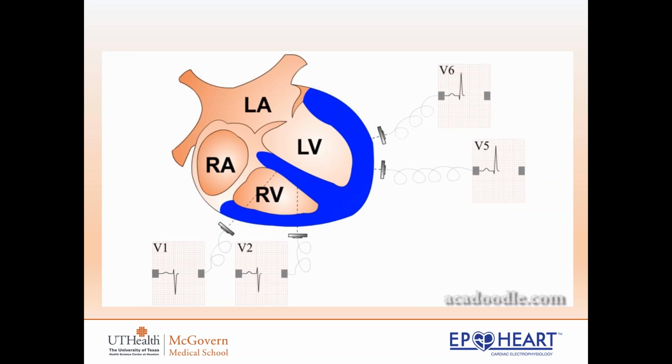When ventricular depolarization is complete, there then follows a period where no current is flowing in the heart, and the tracing returns to the isoelectric line. This period ends with the onset of ventricular repolarization, and as we've seen, because the repolarization wave is moving in the opposite direction to the depolarization wave, the T waves produced in the leads tend to be concordant with the QRS complexes.